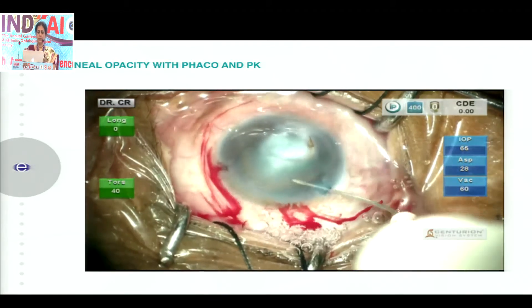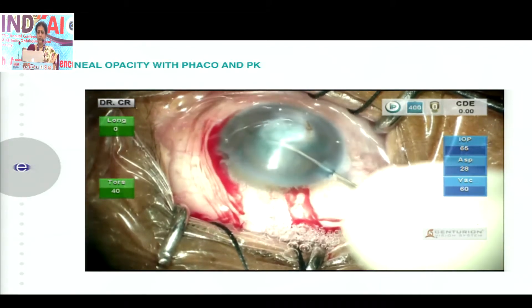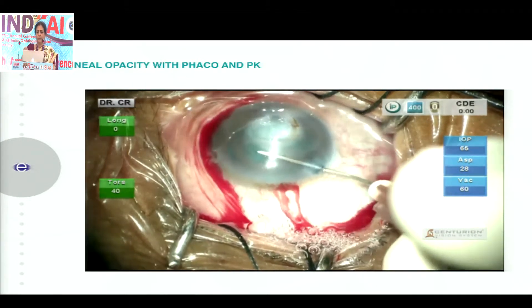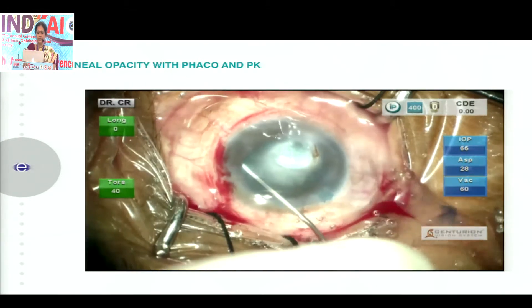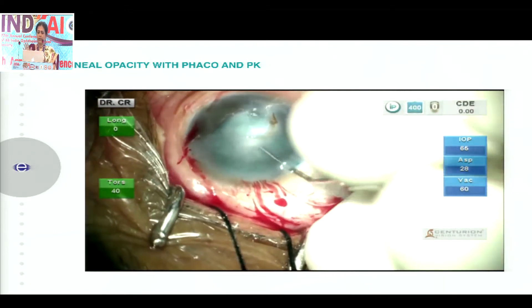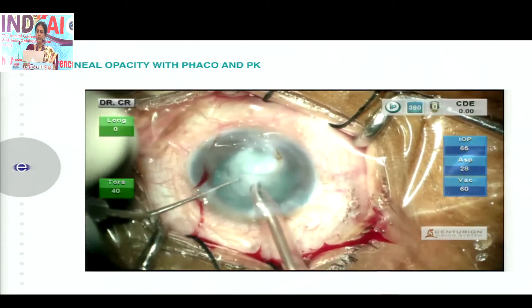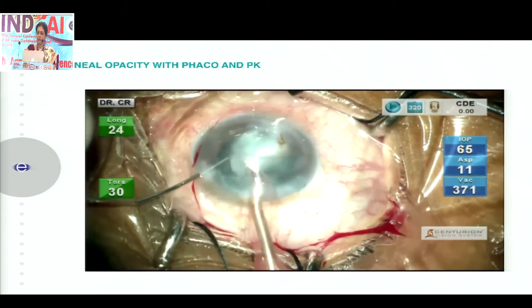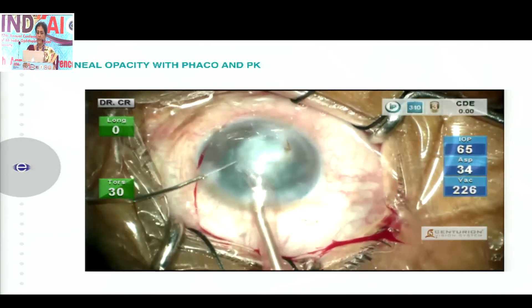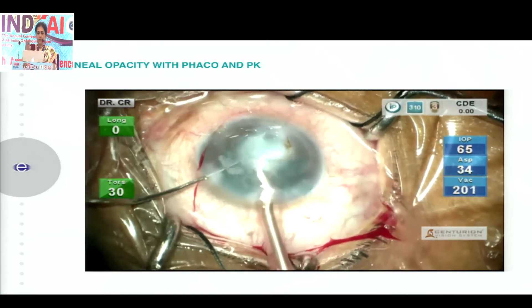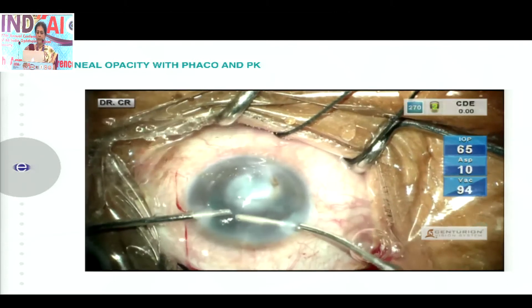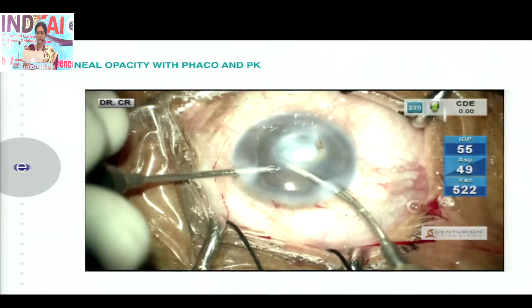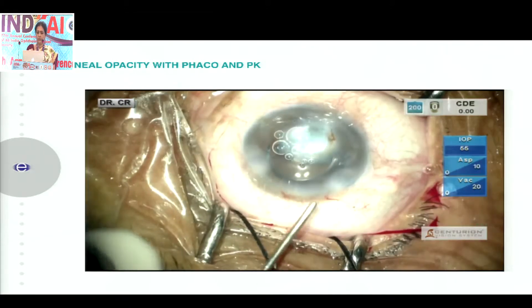Synechiolysis, using dye, and a careful hydro are all steps already discussed. We need to be careful in these cases — these patients are demanding and you need to be optimal. A multi-quadrant hydro could be done and then go on to phacoemulsification. By doing mechanical debridement or PTK, you are actually able to see through the haze in the corneal opacity, and that helps you to continue with your surgery.